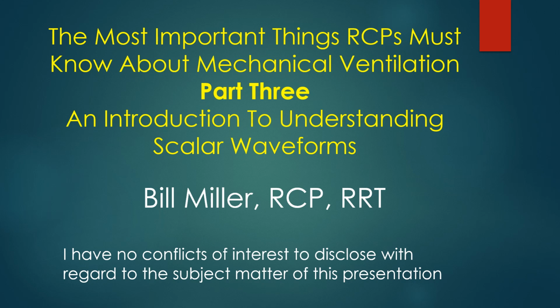Part 3 in the series on the most important things RCPs must know about mechanical ventilation. We'll be discussing scalar waveforms.